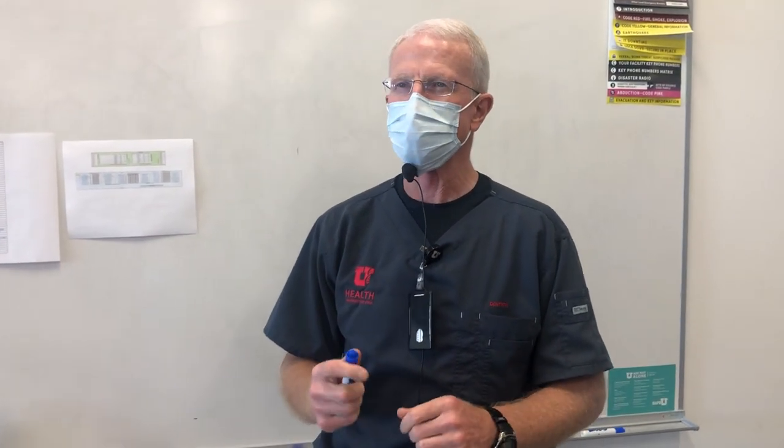It was pointed out to me that you're struggling more with J-lips with the chamfer diamond than with the rounded shoulder. So I think what's happening is you're probably not using the side of that chamfer diamond enough. And you may be approaching your gingival margin, your point of finish, a little bit too soon in the process.